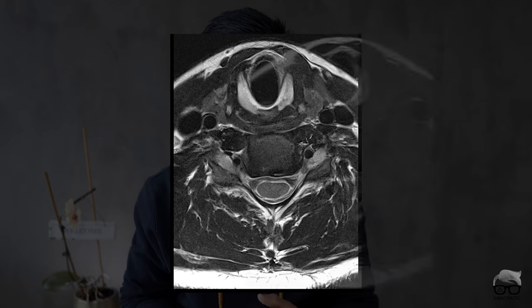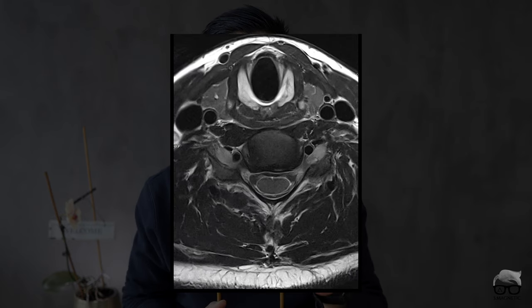Hello everyone, welcome back for another video. Today we're going to talk about neck imaging — not necessarily cervical spine imaging. We're going to go from images like this to this with one simple trick, if you have it available. Stick around, I'll show you.